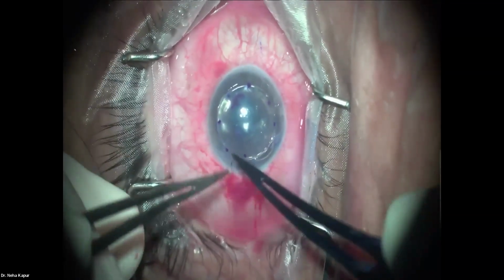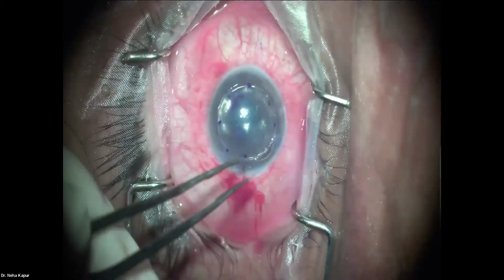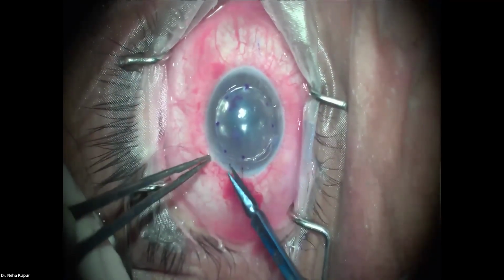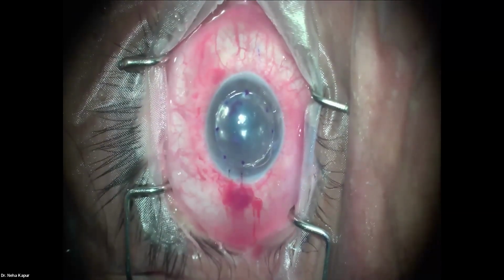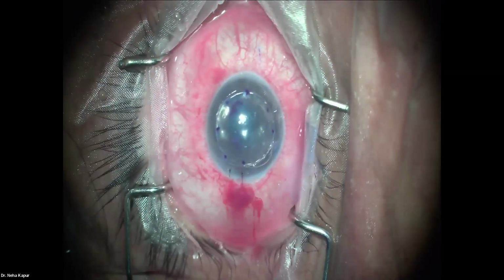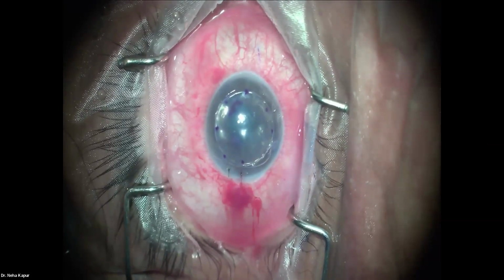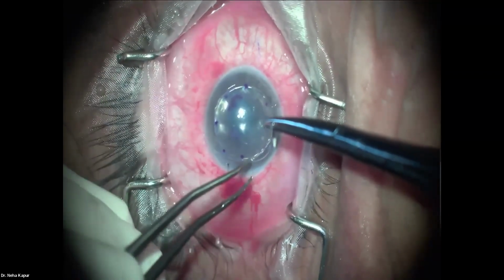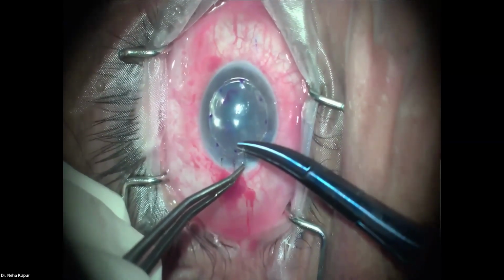So for the microkeratome, usually we use the Nidek microkeratome here, but what is most commonly used is the Moria microkeratome. The head that we use depends on the tissue thickness. If you're dealing with tissue about 570 microns and thinner, we use a 300 micron head. If it's more than 570 microns, we use a 350 micron head.